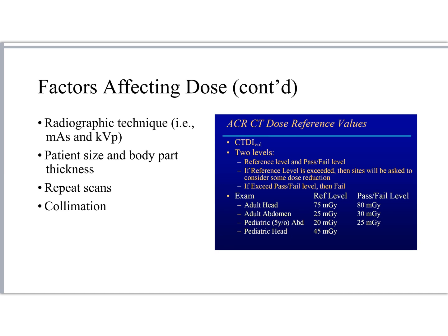All right, so there's also considerations like mAs and kVp. Frankly, they're kind of a can of worms when it comes to CT scanning. So I'm not necessarily going to emphasize those one way or the other, because the reality is with kVp increases in CT, oftentimes the patient dose increases as well, which is very different from other modalities like radiography. So I don't want people to get confused on that one. Patient size and thickness, of course: as patient size and body part thickness increase, we're going to increase dose. Repeated scans and collimation, kind of a no-brainer.